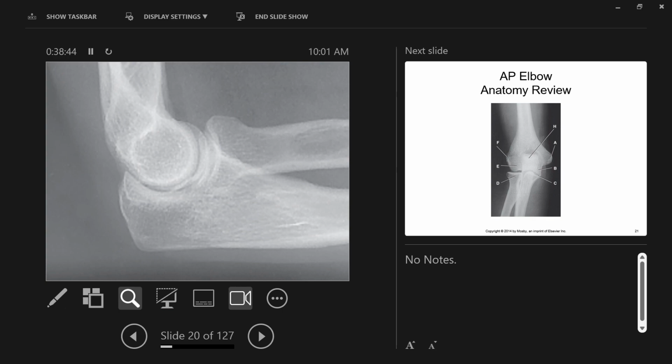Now, as the arm gets raised, the shoulder's up there, right? So as the arm gets raised off the table, our whole reference, our view rotates. What we see will be rotated or distorted from what it actually should look like in those cases, which is why we want to make sure our patients are as flat to the table as they can be.